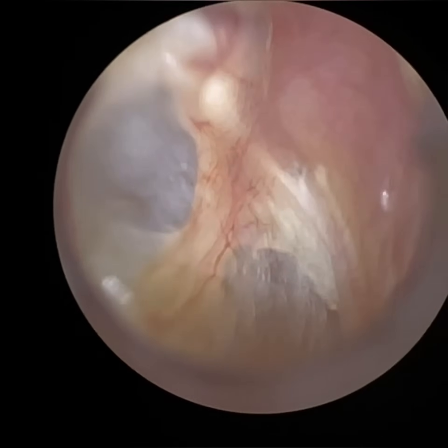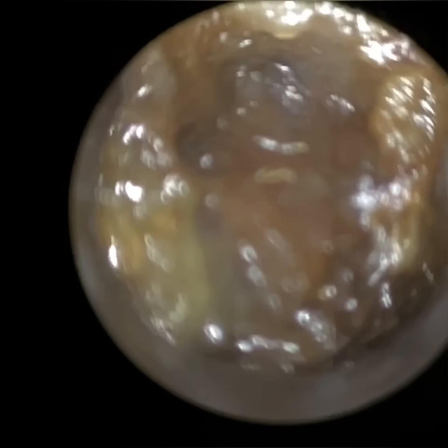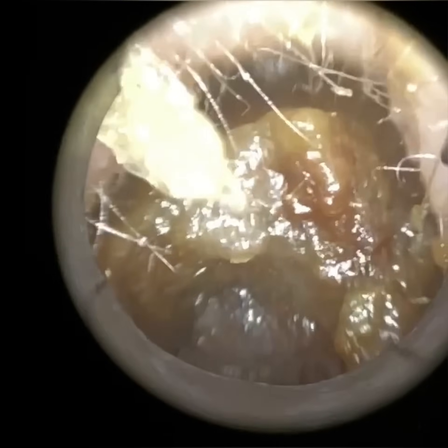So you can see we used the ear hook there to leverage out that extremely large piece of wax. If you watch till the end, you'll see a still image of that piece of wax and just how big it was. The eardrum was healthy and intact — some scar tissue there, some tympanosclerosis. The patient is in their 90s, so you would expect some scar tissue forming on the eardrum at that age.